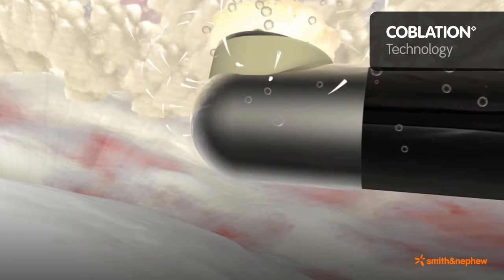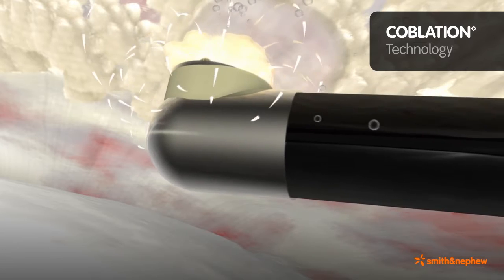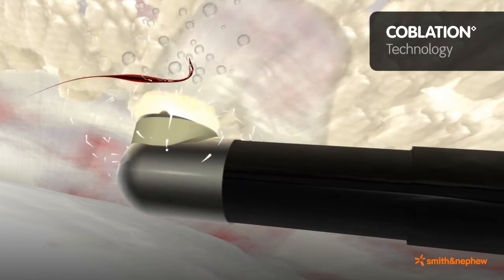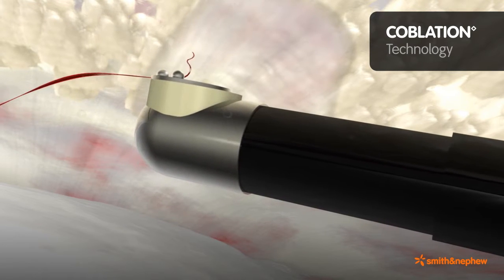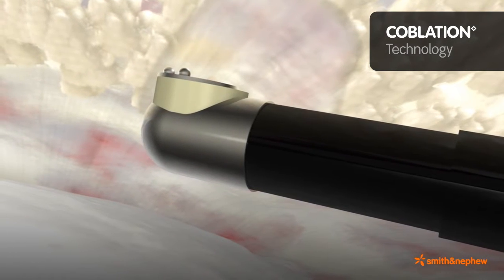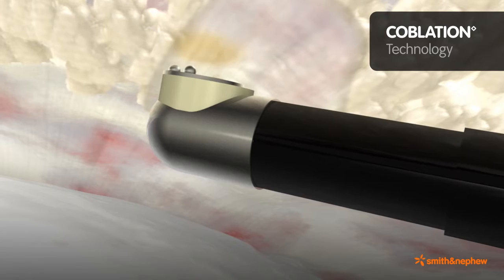The plasma is formed by creating a high-density energy field within an electrically conductive fluid, such as saline. Localized heating of tissue coagulates bleeders to maintain a clear field of vision.